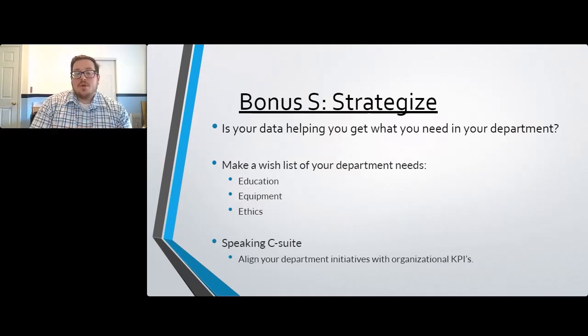so what I want to do as a sterile processing leader is I want to make sure that what I'm asking for helps support or falls in line with what the organizational KPIs are. So what that may look like is the market goal, the hospital goal is to reduce SSIs from ortho cases. Well, hey, I need a borescope, and my justification for getting this borescope is to reduce ortho SSIs. And now we have alignment.